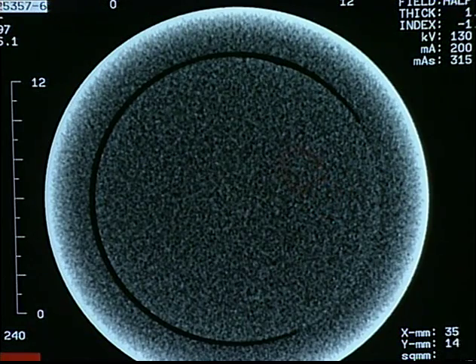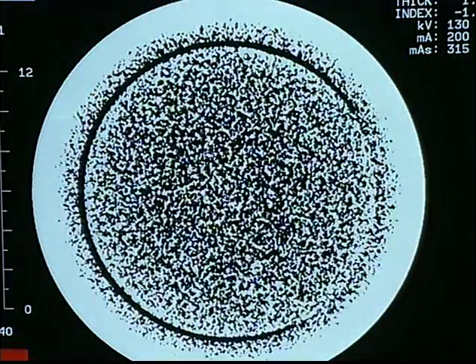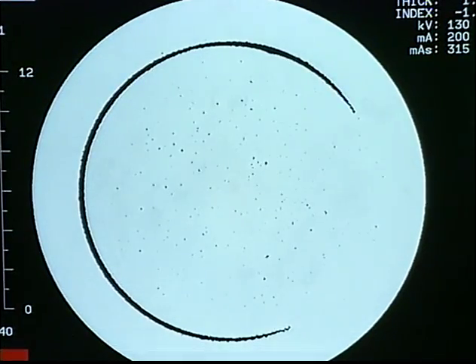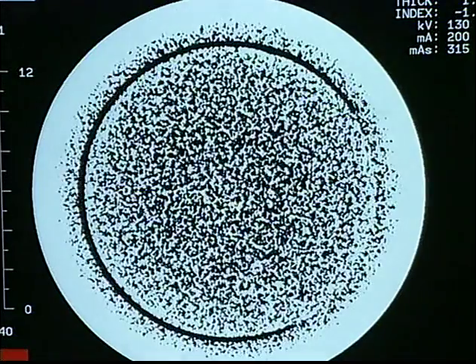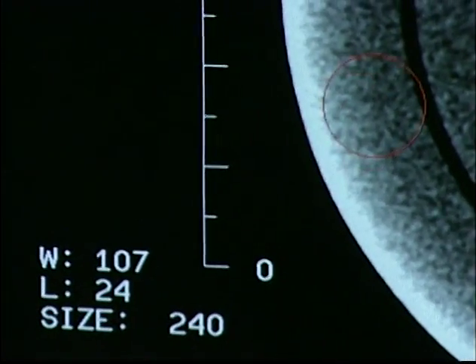This tests the image uniformity and noise characteristics such as standard deviation. Closing the CT window, you may be able to visually identify non-uniformity problems, including rings, cupping, capping, and other artifacts. By selecting a profile which runs across the phantom, uniformity trends can be identified. To measure the image uniformity, use a constant ROI size, typically 2 to 4 centimeters in diameter.